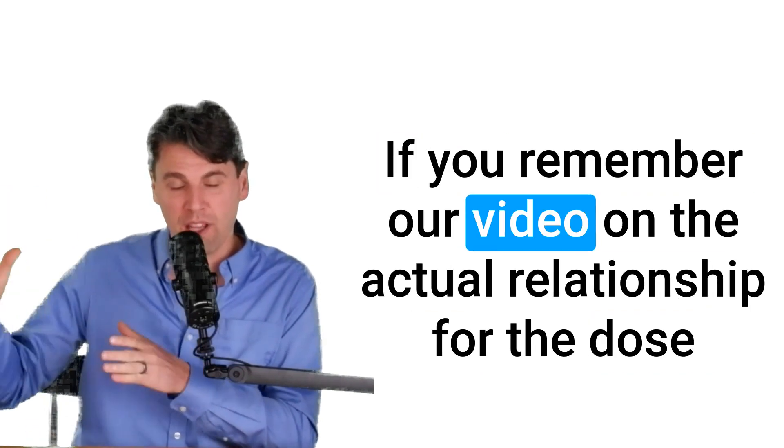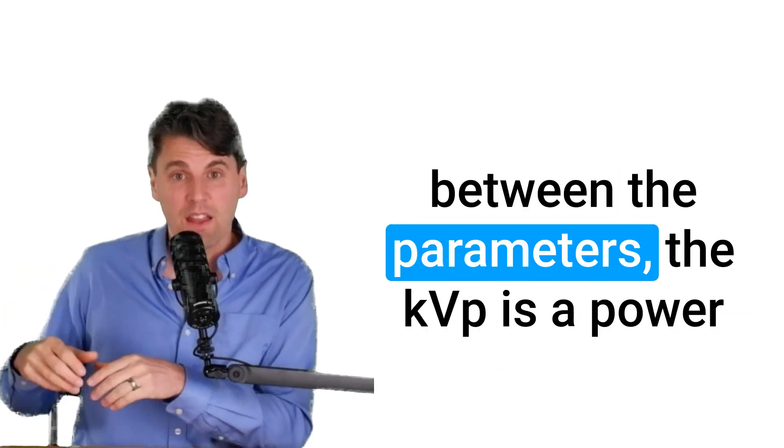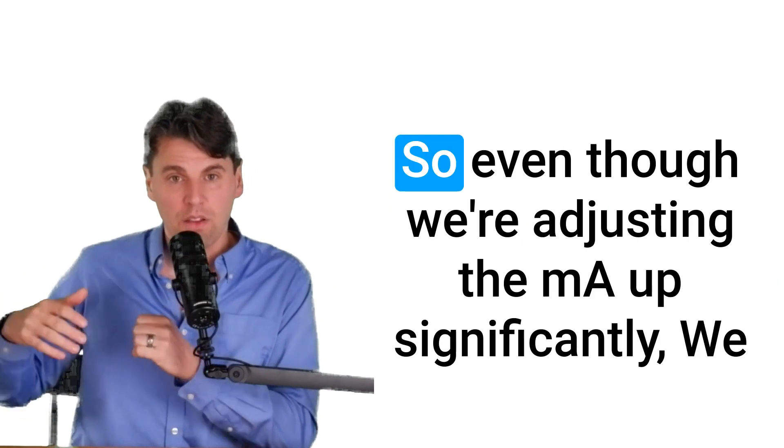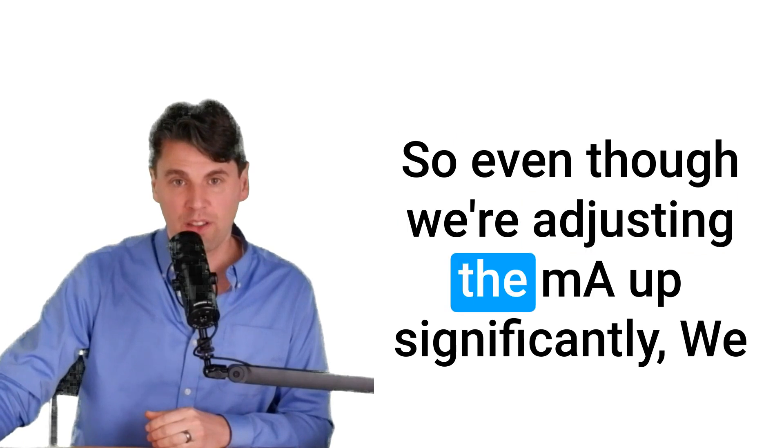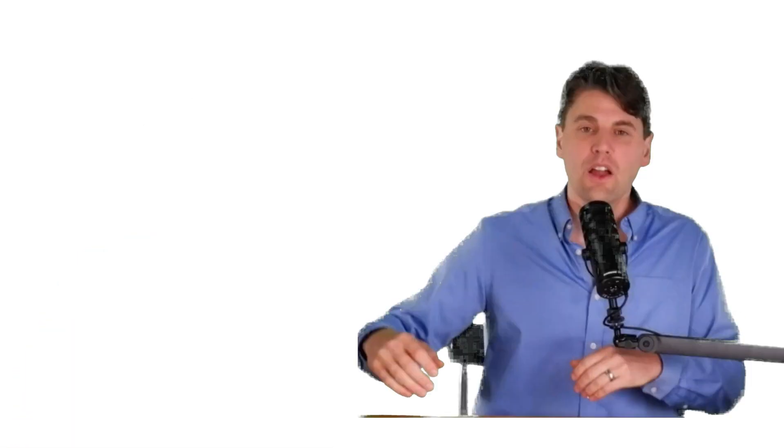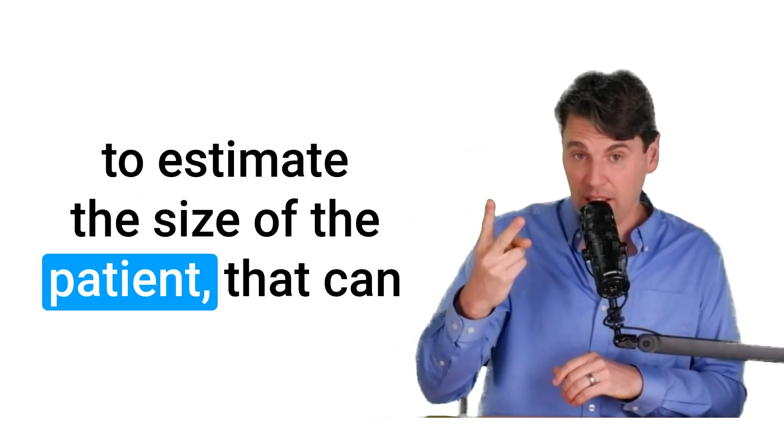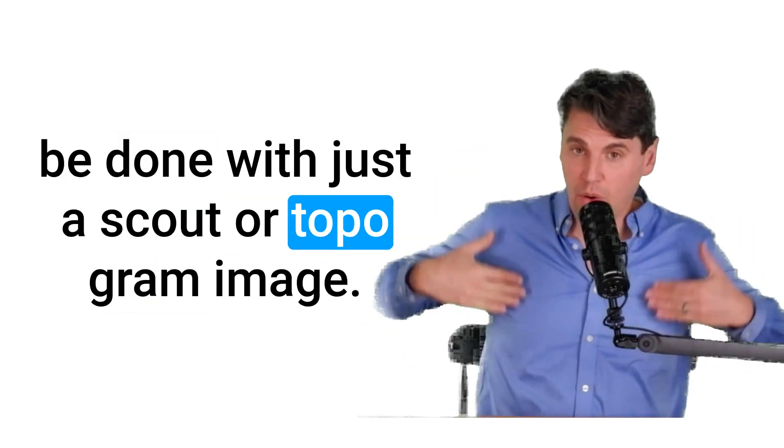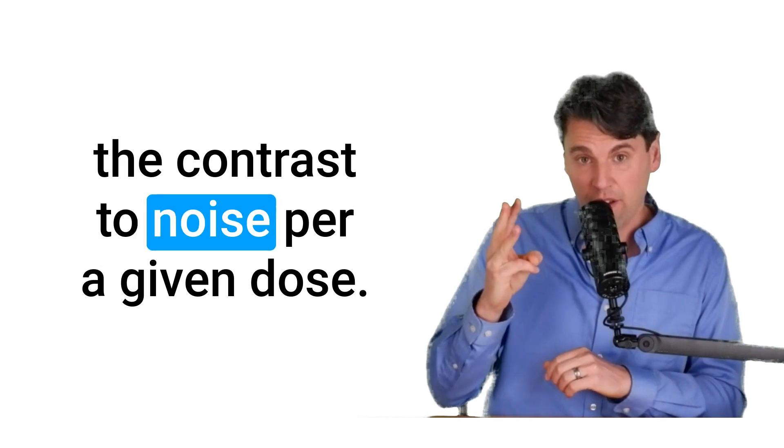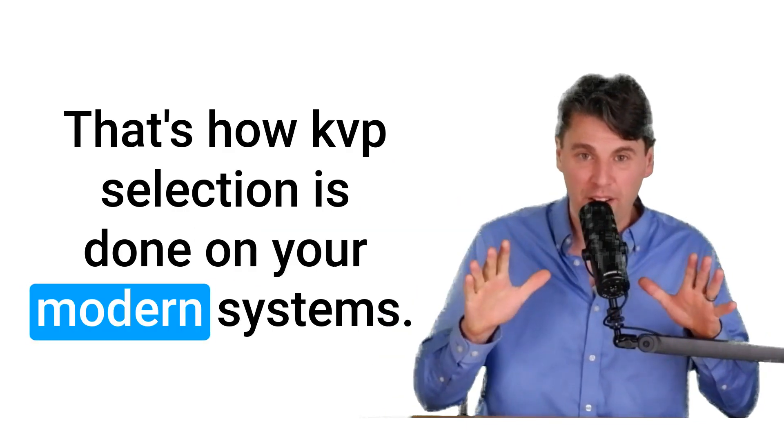If you remember our video on the actual relationship for the dose between the parameters, the KVP is a power law and it goes up much more quickly than the MA. So even though we're adjusting the MA up significantly, we can be doing so and still be saving dose for the patient. So the ability to know your diagnostic task to estimate the size of the patient that can be done with just a scout or topogram image and then to use those things in order to optimize the contrast to noise per given dose. That's how KVP selection is done on your modern systems.